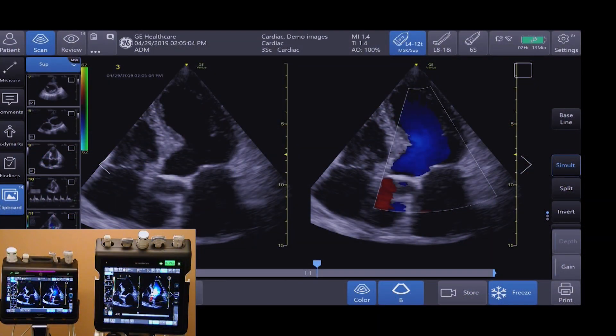Both the Venue and the VenueGo have the same software and similar interfaces. The Venue has a 19-inch monitor and the VenueGo has a 15.6-inch monitor. The VenueGo's color bar, located at the top of the screen in pink, can be customized for each department for easy identification.